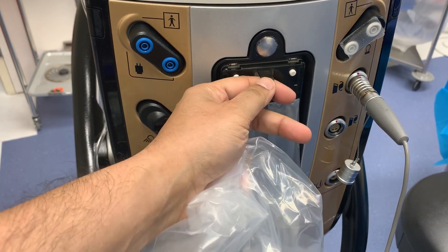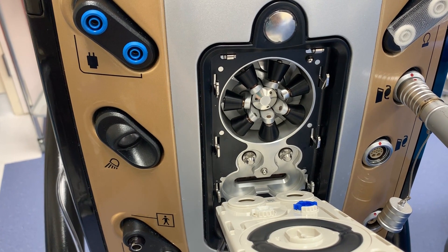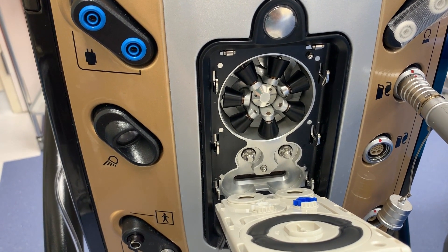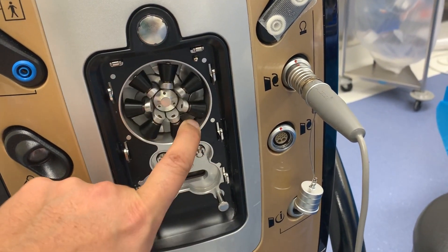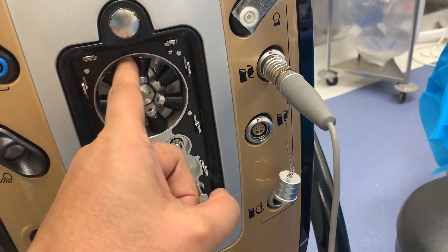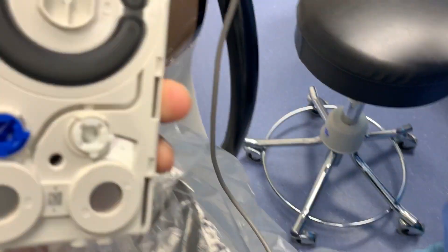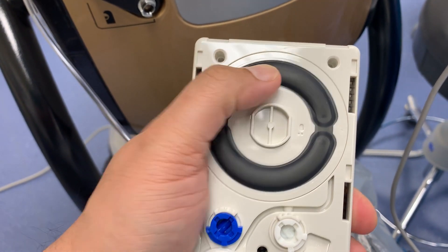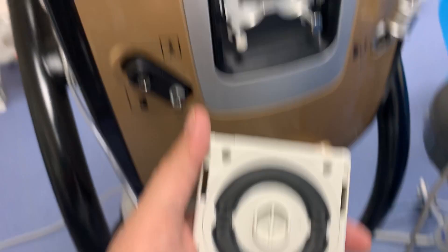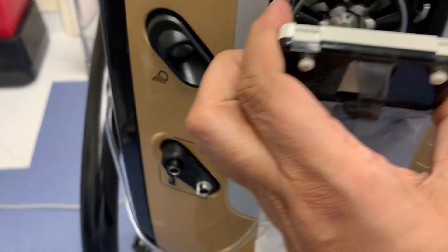Opening the machine up, we can see — ejecting the cartridge here — there are the pinch rollers. That's the peristaltic pump. These rollers rotate and compress the other side, which has a softer backing, and the fluid is pinch-rolled along this area. The fluid is then drained into the plastic bag that hangs on the front.